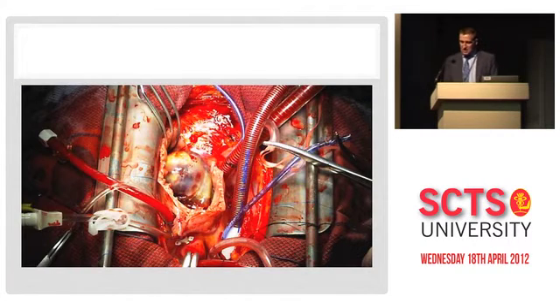And there you can see a photograph. When our surgeons complain about us using phones in theatre, then they always ask us to take pictures of the pathology, so that's our excuse. The appearance of the myxoma is very much like it is on the echo images as well. You can see the irregularity and the sort of large nodular shape of it. So that's sitting in the right atrium. You can see the surgeons put a SVC and IVC cannula in so he can open the right atrium and really get at this thing.